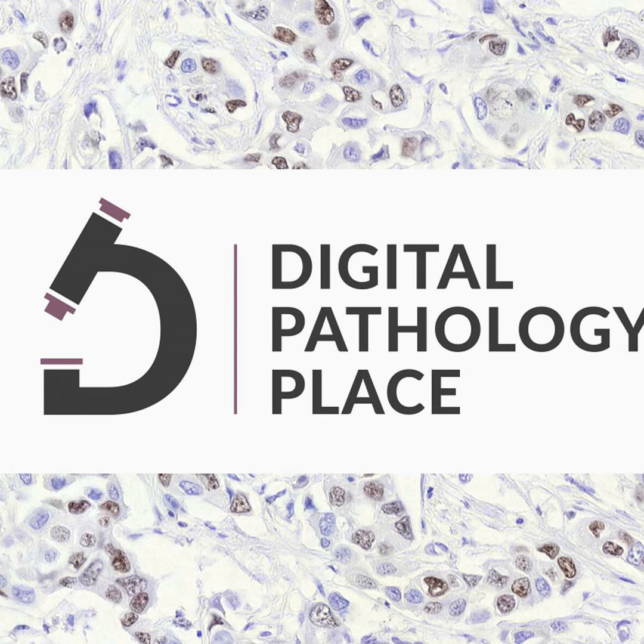I remember distinctly, like I said, I didn't create telecytology, static telecytology. There actually are a couple of veterinary universities that offer that as a service. So you send in photos, but they do it through email. It's not through an app. And I remember when I first heard of that, I remember thinking, I don't think I'd be comfortable evaluating a slide through just photos of certain areas. Mm-hmm. And it's funny, here I am now, because I do realize the utility of it, that you can diagnose, or you can at least get a lot of clues from well taken photos, having multiple objectives, multiple areas.